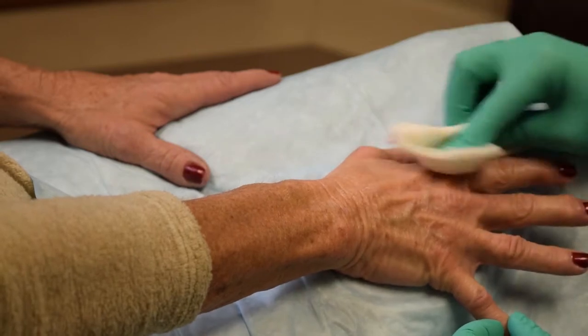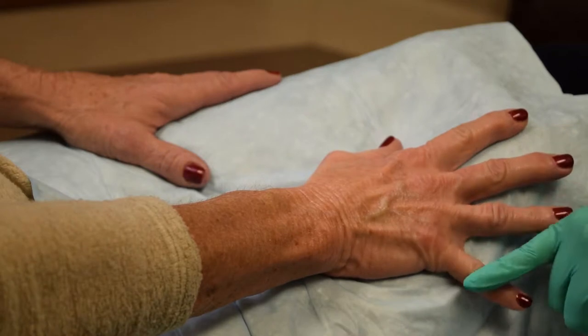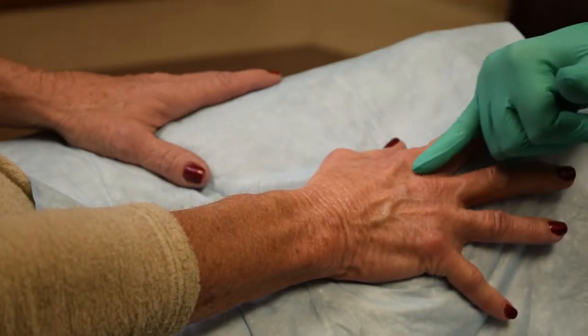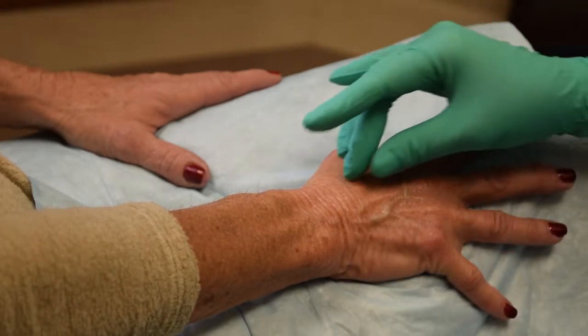The area is generously prepped with chlorhexidine. The patient previously washed hands thoroughly and removed old jewelry. In this patient, volume loss and thinning of the subcutis has led to formation of hollows, visible tendons at rest and with flexion, prominent veins, and many transverse wrinkles.